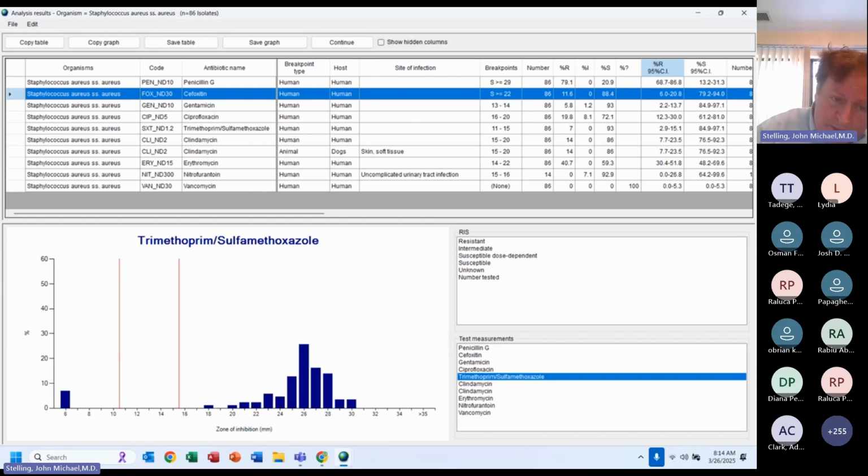A few comments: everybody agrees that 18 is susceptible. So in fact, they do not disagree on which bacteria are susceptible. For humans, we have an intermediate range separated from resistance, but for cats and dogs, they don't distinguish between I and R. So in this particular example, the breakpoints are very similar. They agree on susceptible. Other times, the breakpoints are quite different.